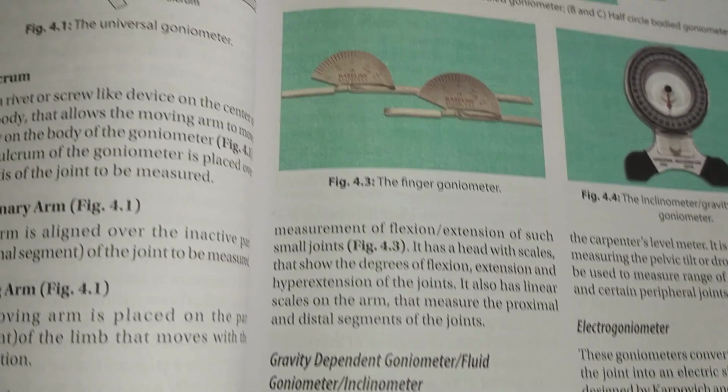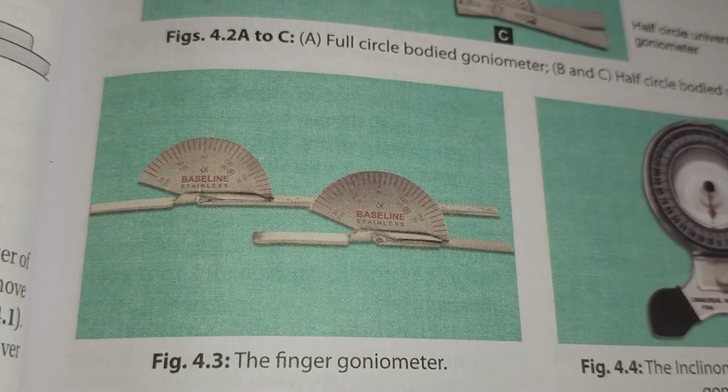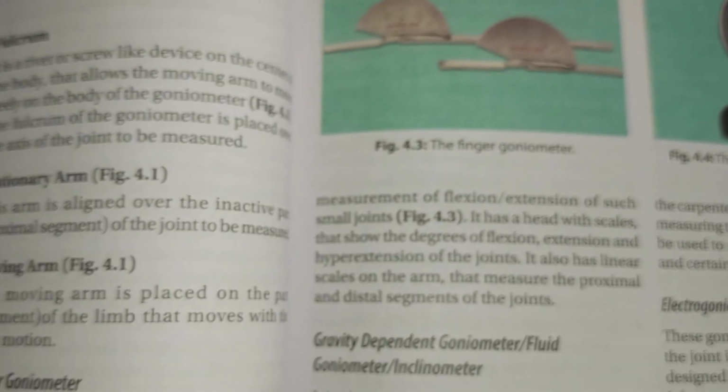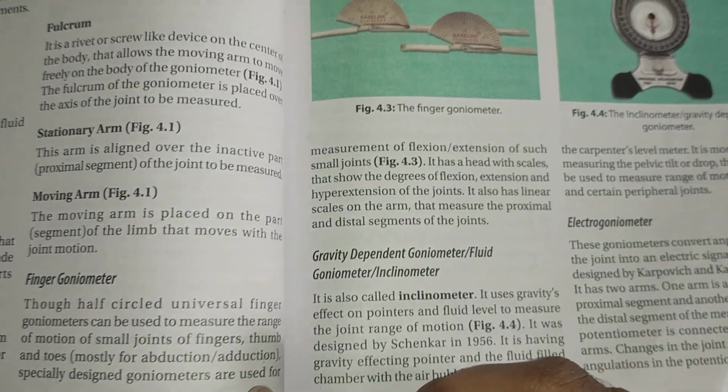It has figure 4.3. These are the finger goniometers for small toe, fingers, and thumb.